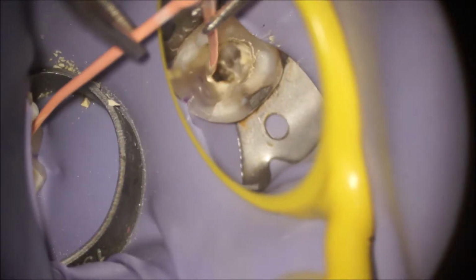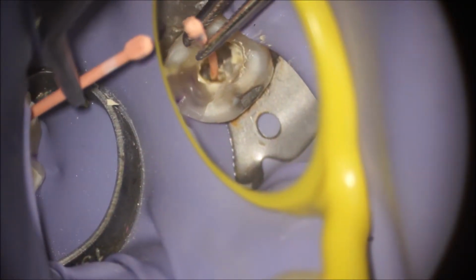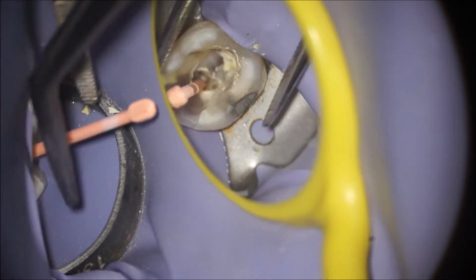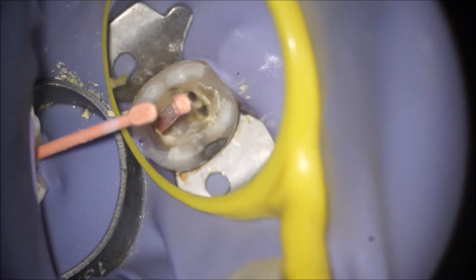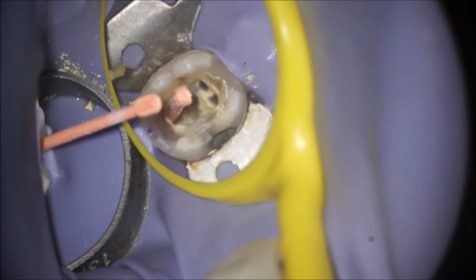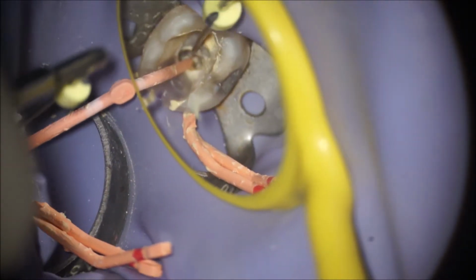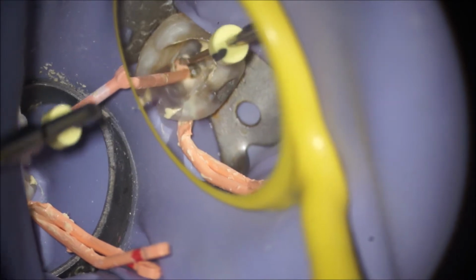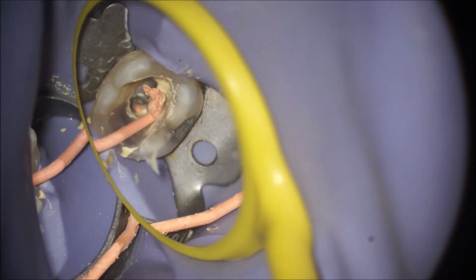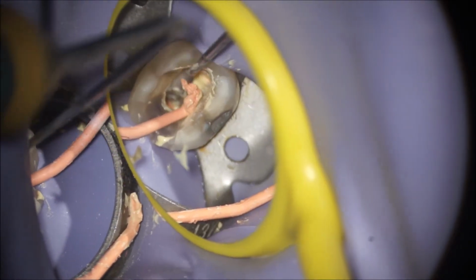Happy with the cone fit and the tuck back, so we proceeded to the obturation. As you can see from the size of that GP cone, it was the WaveOne Large for the distal canal. And I mentioned just now we got some good tuck back there. Funny the mess you make. You only see that on the video afterwards, like those two red GP cones for the mesial canals. I forgot to even take them out.